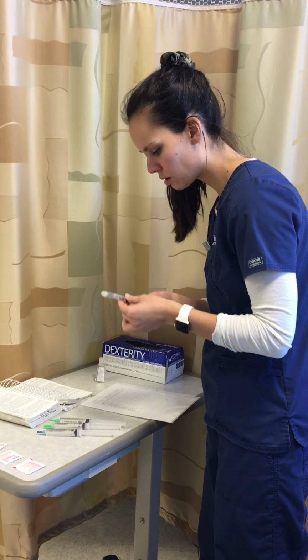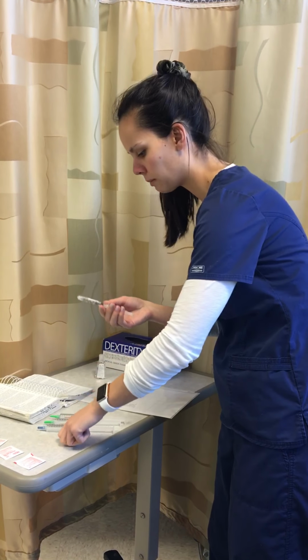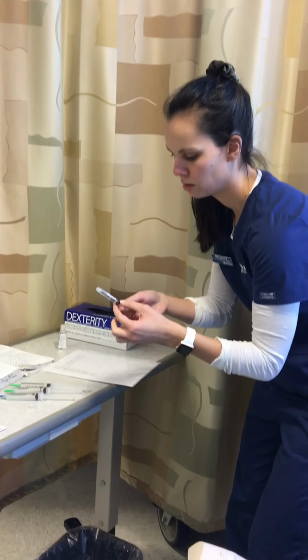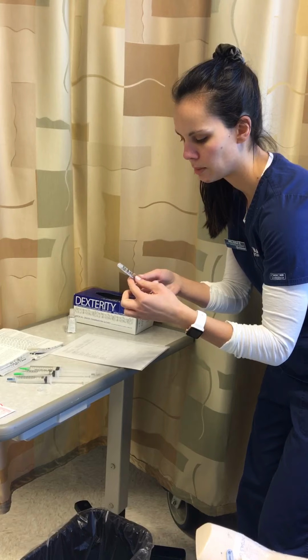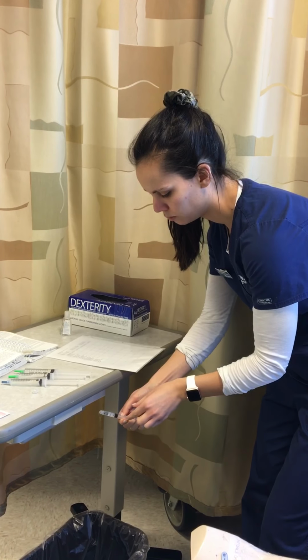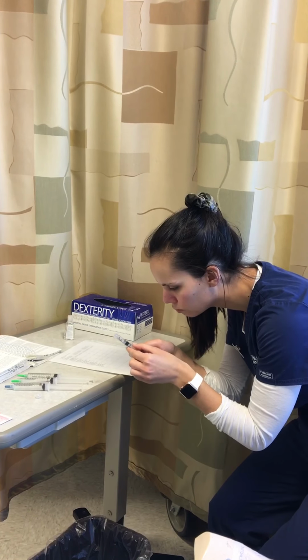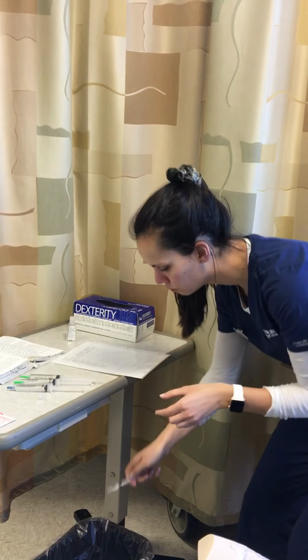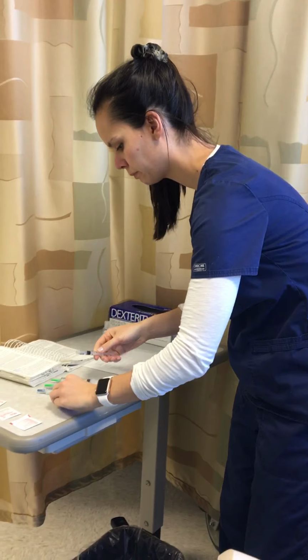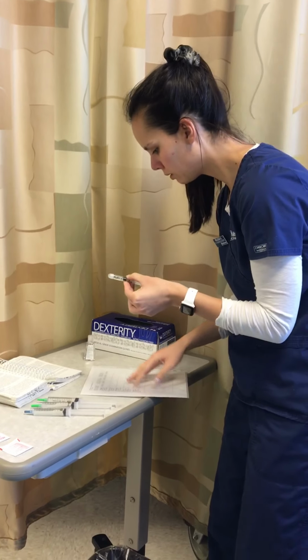Okay, so I am going to get my Zofran here. I'm going to waste it to 1.6 milliliters. Cap back on.